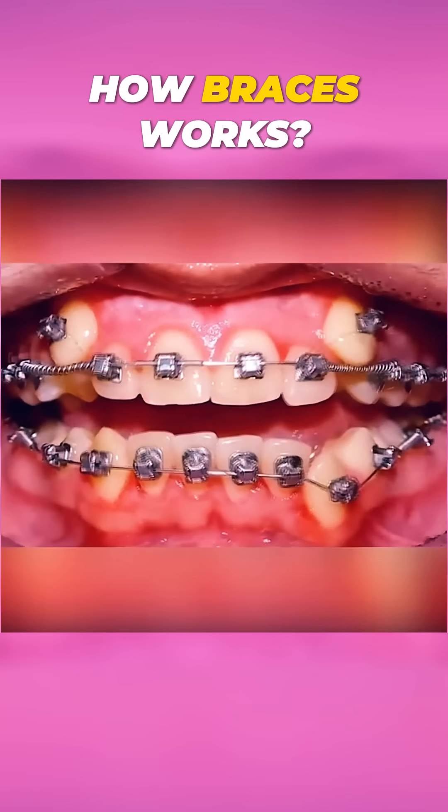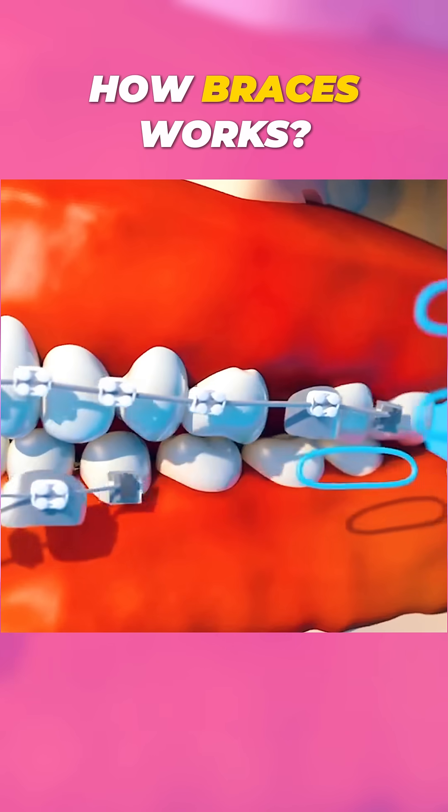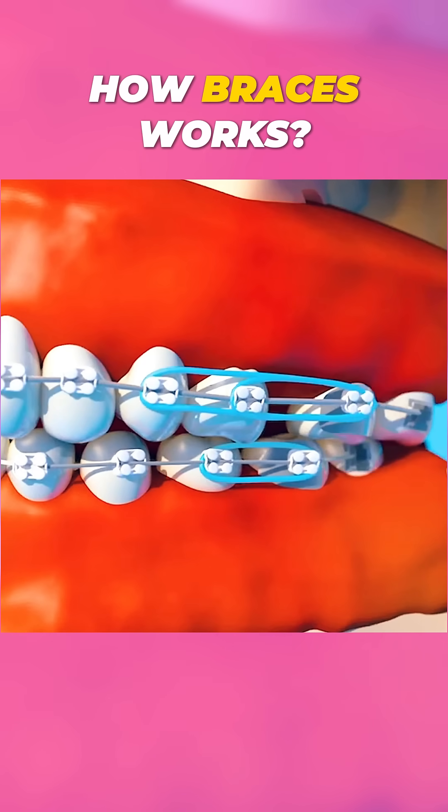Over time, the constant pressure shifts teeth into the desired position. Rubber bands may also be used to correct jaw alignment, connecting upper and lower brackets.